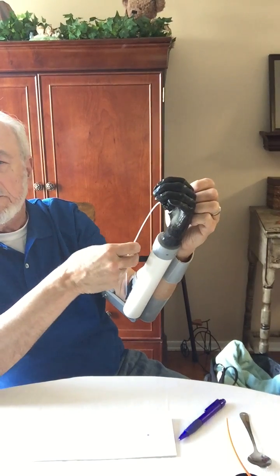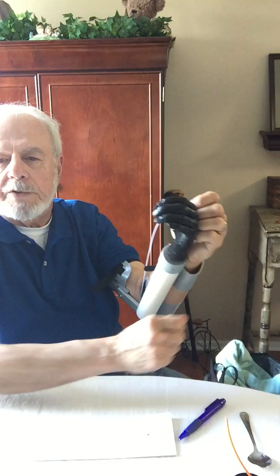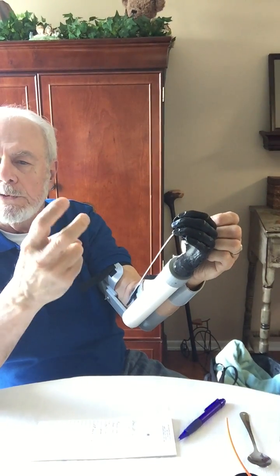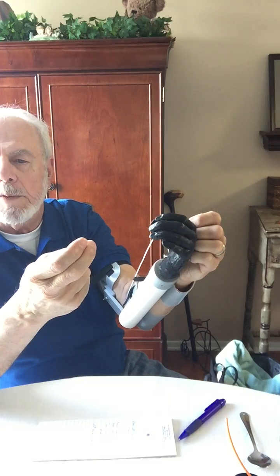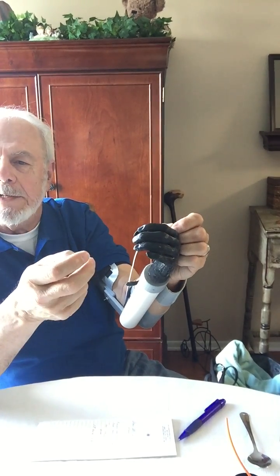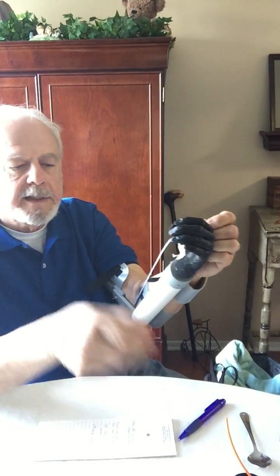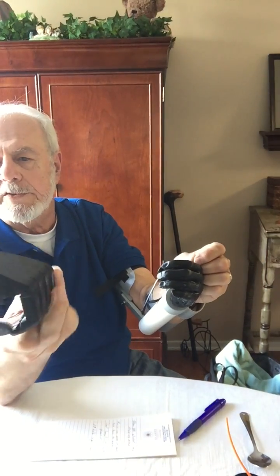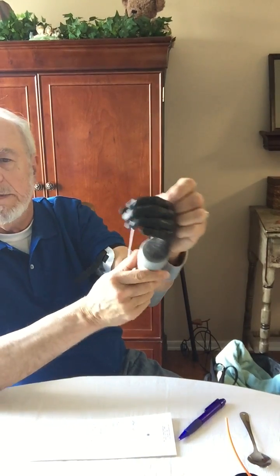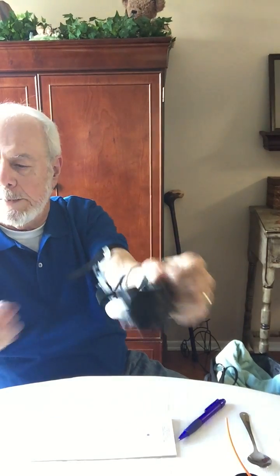There's a Bowden cable that normally would be connected to a shoulder harness. So when the user moves his shoulder, it pulls the cable and it opens a normally closed split hook. It's held in place with a rubber band. Well, the normally closed idea, rubber band holding it closed, is something we've been delighted to work out with terminal devices like the thing we're calling a gripper thumb. And the one that I'm showing you now is a more cosmetic, normal hand-looking version of the gripper thumb.